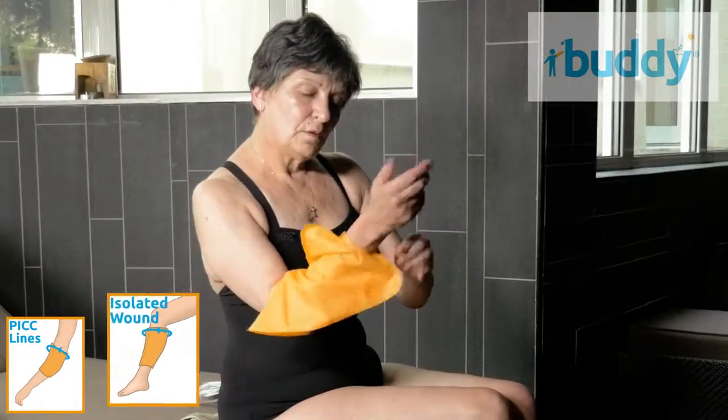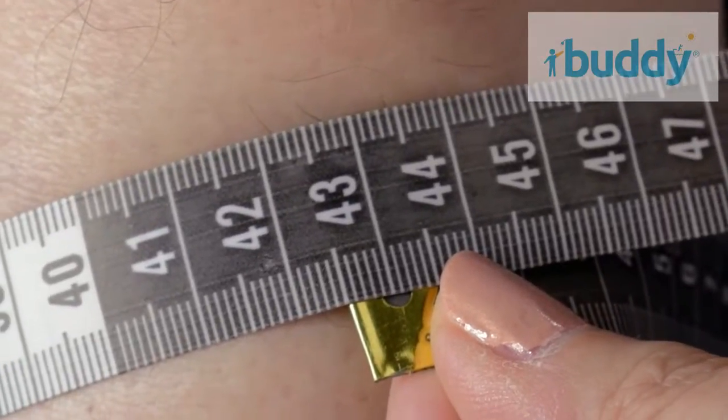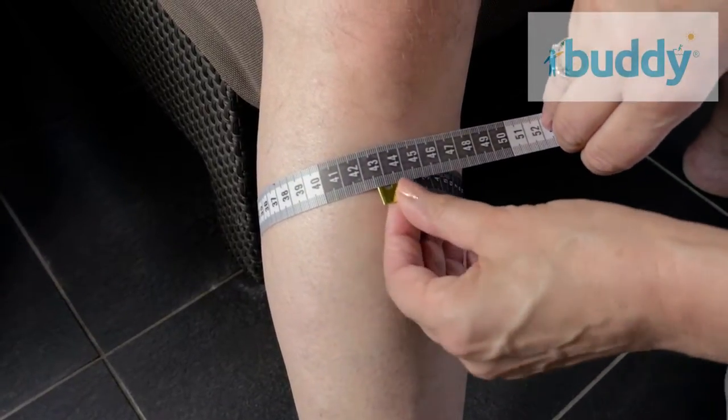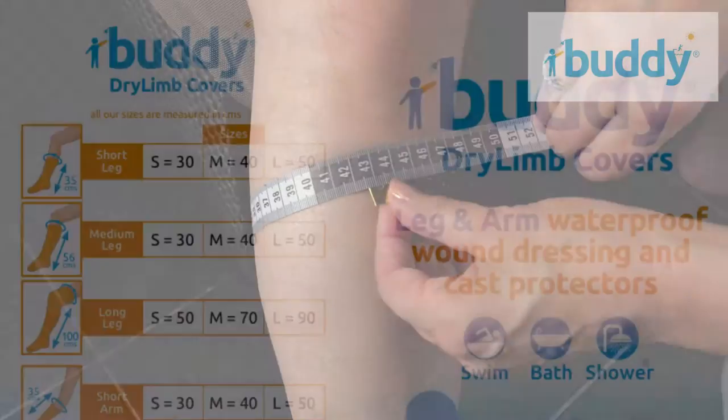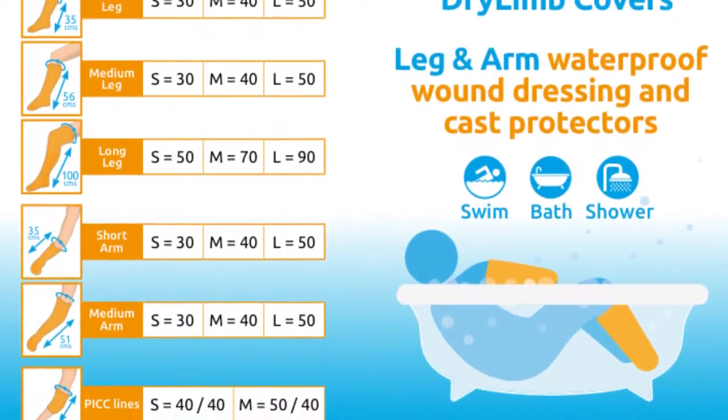To order your Buddy cover, first measure in centimeters around the fleshy part of your limb, approximately four centimeters above or below the cast or dressing. Then check the size guide on our website, rounding up to the nearest size to ensure the correct fit for you.